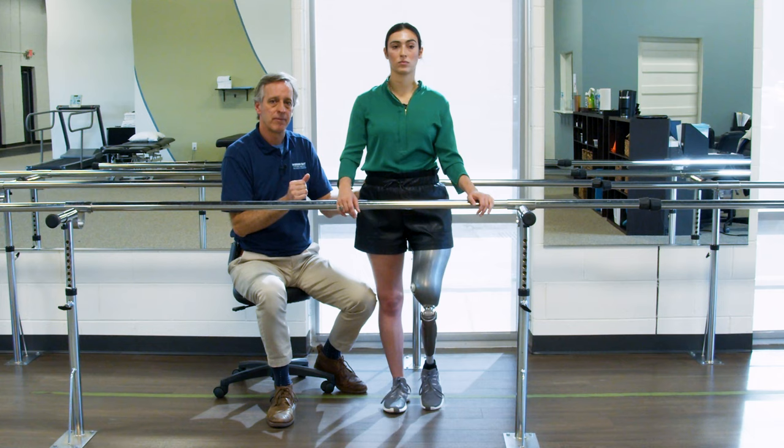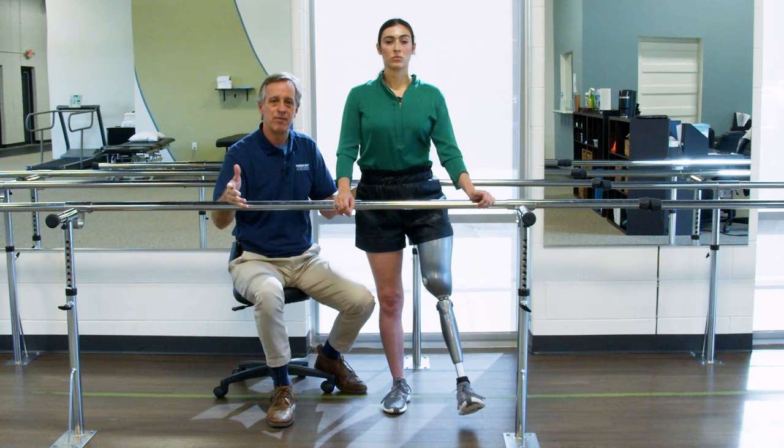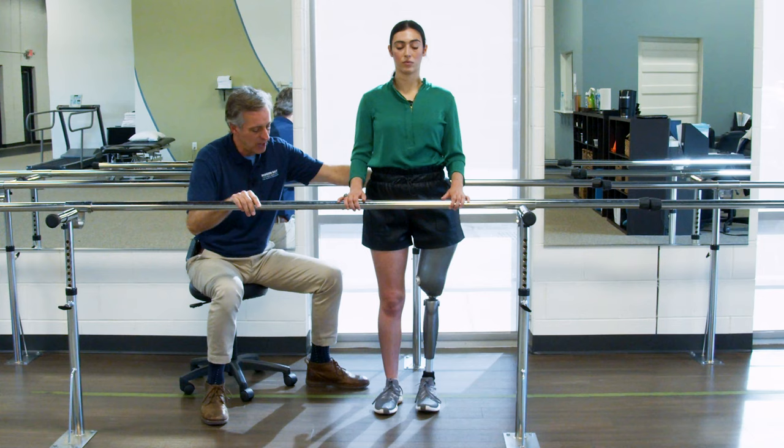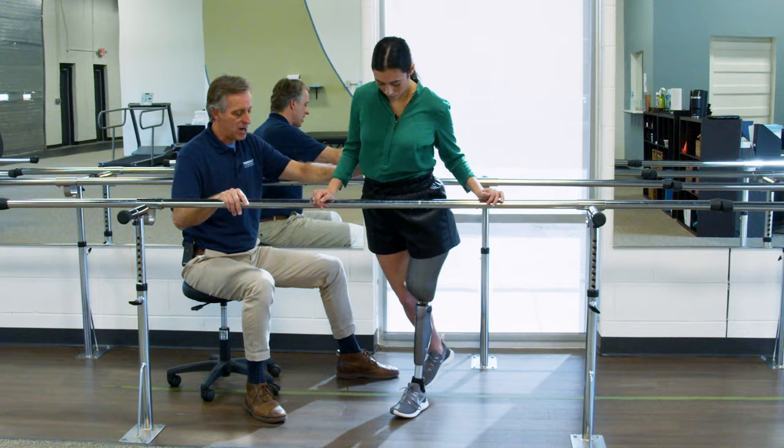The next drill, really important, is what we call braiding, karaoke, grapevine. People call it lots of different things. But this idea of crossing one leg over the other, establishing the foot support position, hands back on the bars, if you don't mind, Tracy. And I just want you to bring your prosthetic over the front, focus on loading it heavy, and then step out and recapture a neutral position.